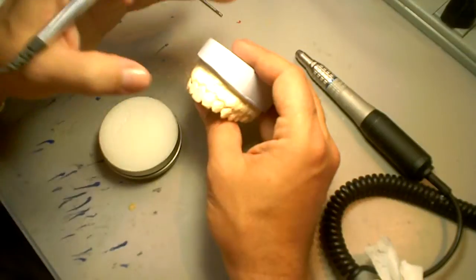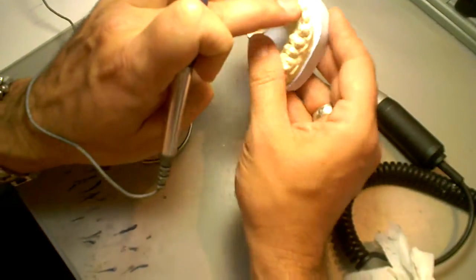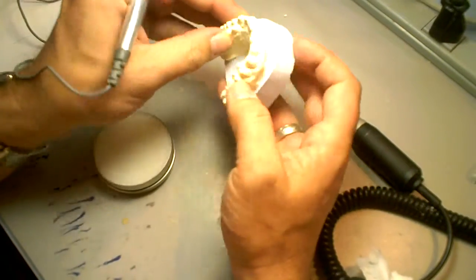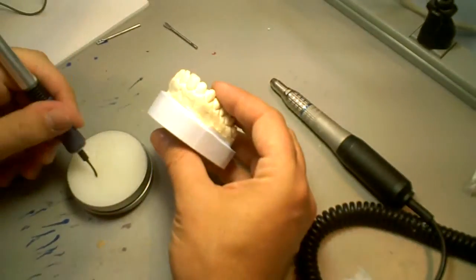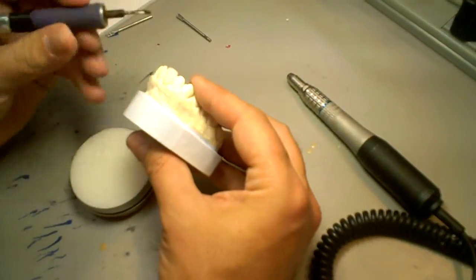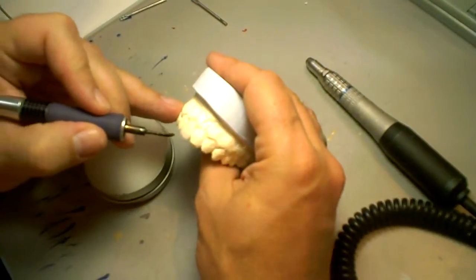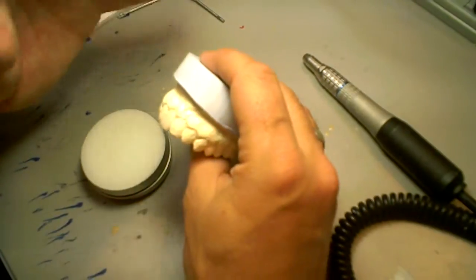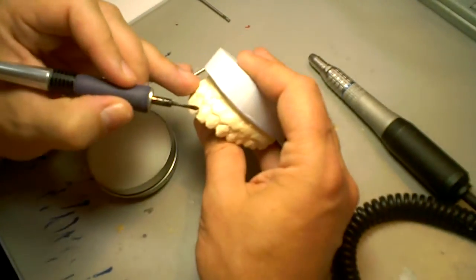So I have my first central pretty much where I want it. Again, I look at this view. Make sure that I'm following my arch. I'm in the right position. So I'm just going to fill in little gaps. At this time, I'm not going to contour it. Since I'm fresh and I'm seeing what I'm doing, I'm going to start the next central, because those are very important that they match perfectly.